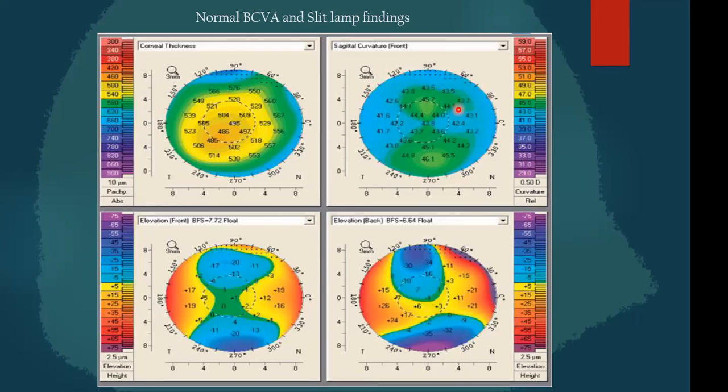So it looks like a central steepening, but you must never confuse it with a keratoconus, because in a keratoconus you will have somewhere a very thin pachymetry, whereas in a hyperopic LASIK the pachymetry is going to be always uniform all throughout. Only in this keratometric map you will see a central steepening in approximately the 7 mm zone. That's how you differentiate between the two.